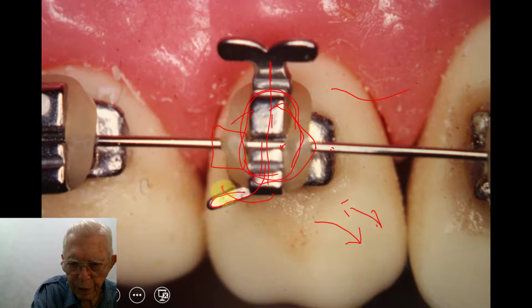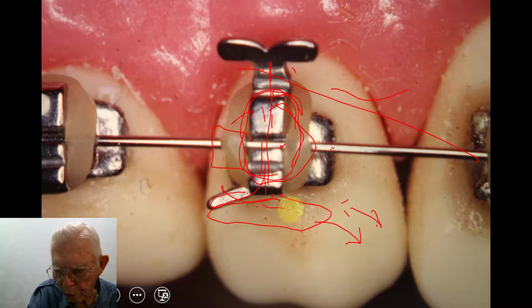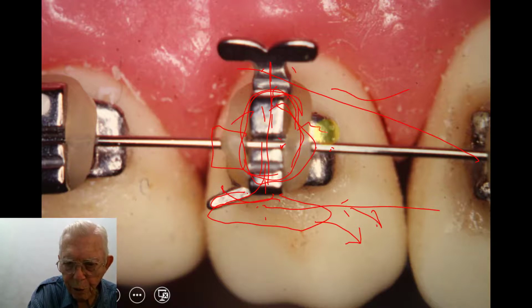You drop in here and bend the end up, and now you can hook an elastic to this, or you can put it in from this side and have the ears down here and bend this wire over up there, and you can hook to the bottom of the tooth. So you can hook any way. And I'm not selling any brackets. Nobody's ever given me a set of them or anything about it, but I can do most anything you can do with any bracket. A bracket is just a device that you bond onto the tooth right here, and you can take that same bracket and you can do most anything you can come up with on that. It's just grabbing a hold of the tooth.